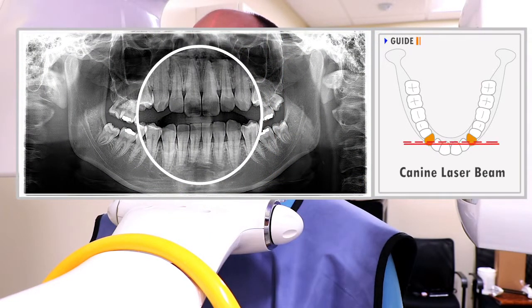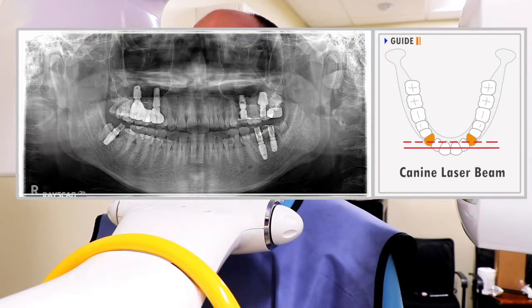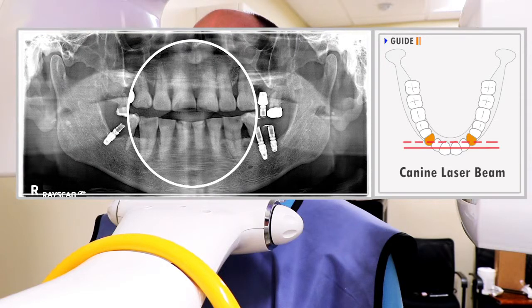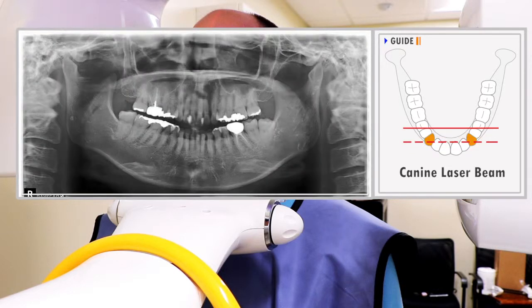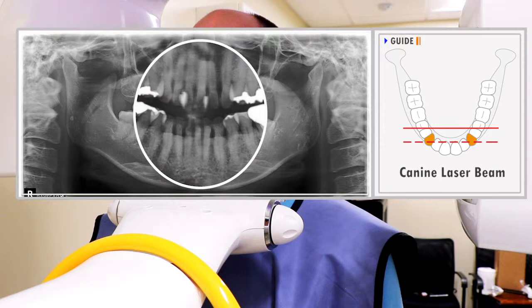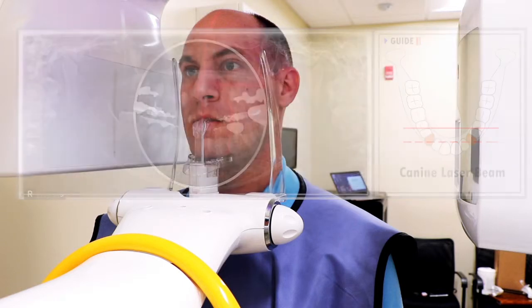If the laser is located ahead of the canine, the anterior teeth area may appear wide and blurry. If the laser is located behind the canine, the anterior teeth area may appear demagnified and blurry.